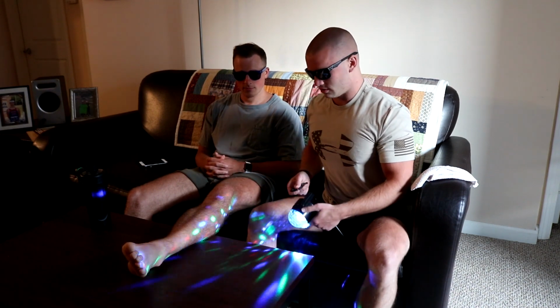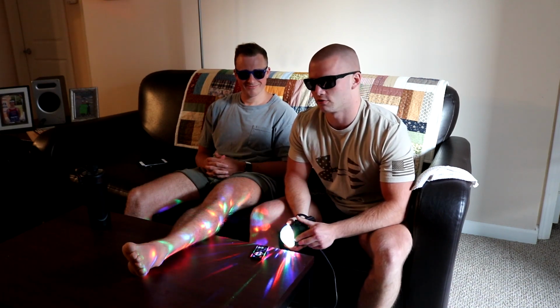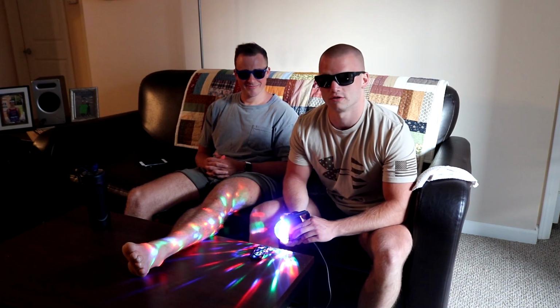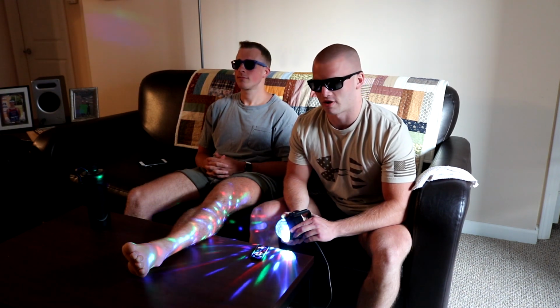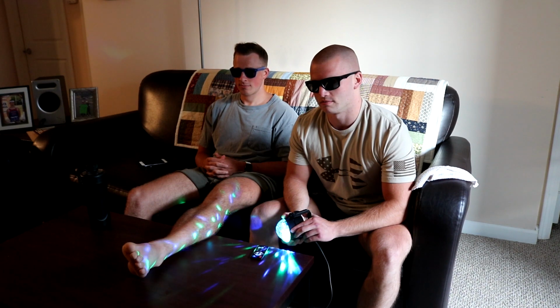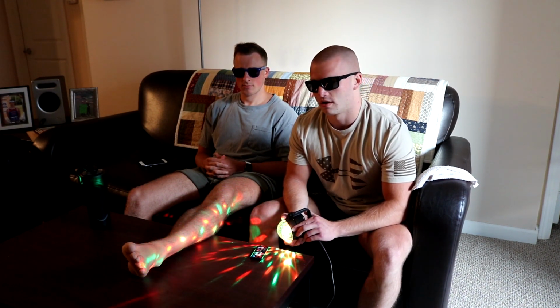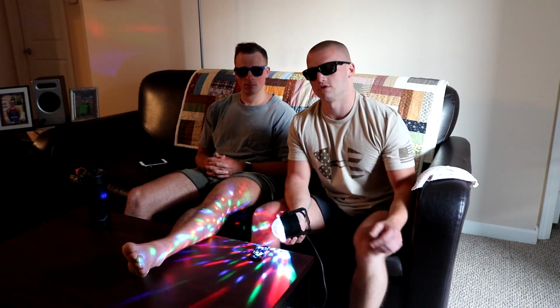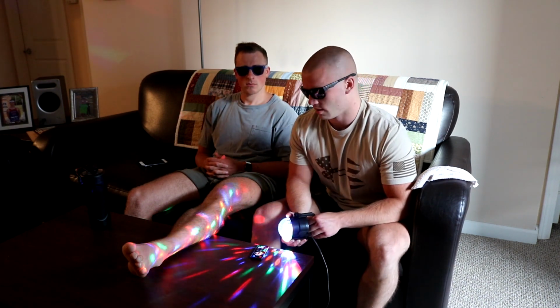And then when you turn on the machine, you can select the power, and this is in the form of energy density, which is measured in joules per centimeter squared. For a chronic injury, you're going to want to set that anywhere from 10 to 20 joules per centimeter squared. And you'll increase the dosage, so if the patient's coming back in subsequent sessions, then you can go anywhere from 10 to 15 to 20. But for this first session, we would use 10.